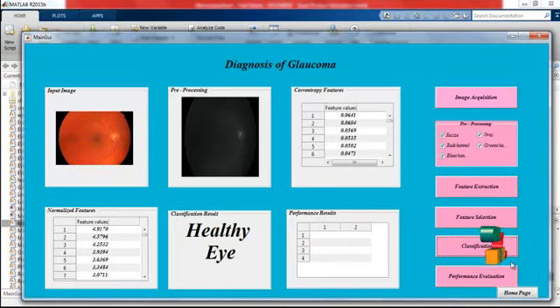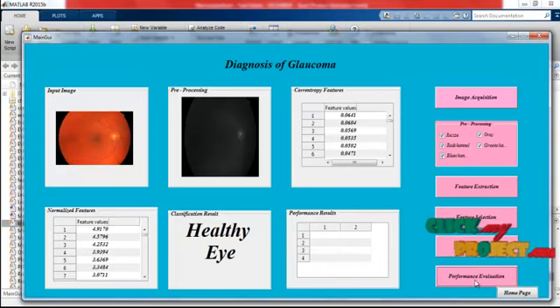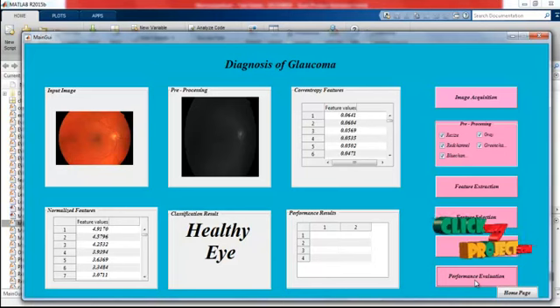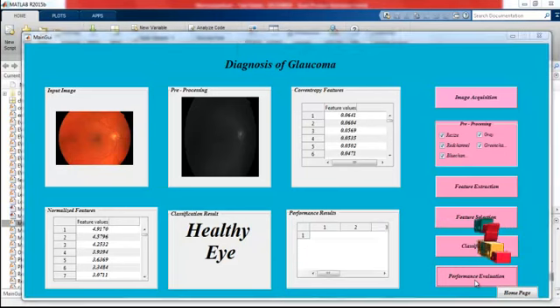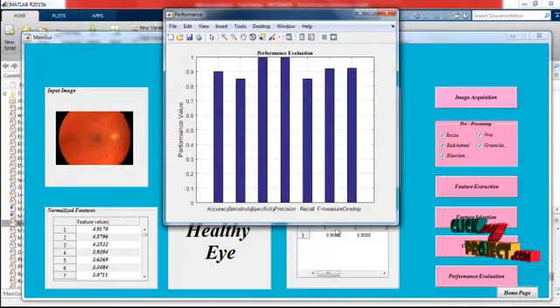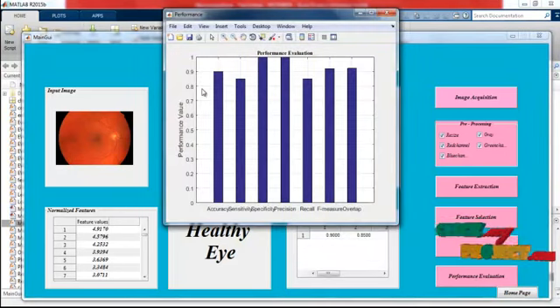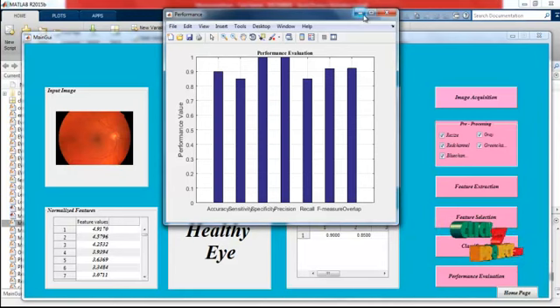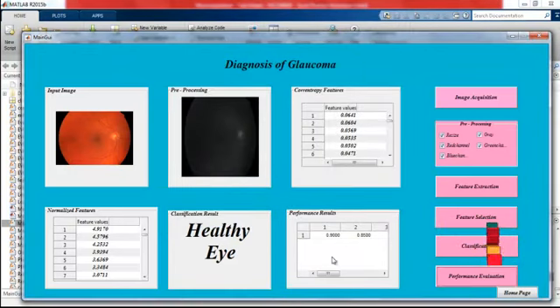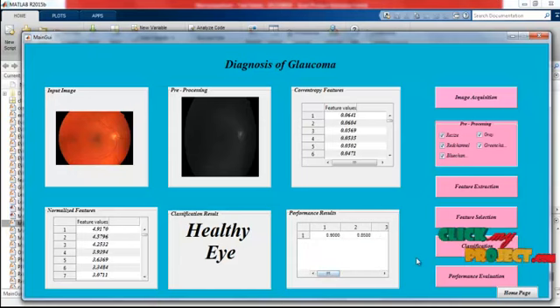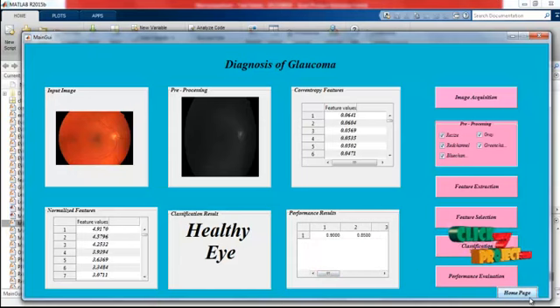Finally, the performance evaluation is selected, which displays accuracy, sensitivity, and specificity values along with a performance graph showing the overall results. These are the performance values of the proposed system. Thank you for listening.